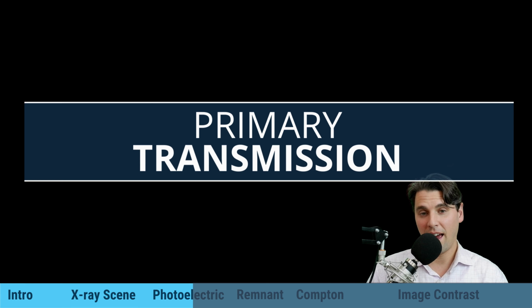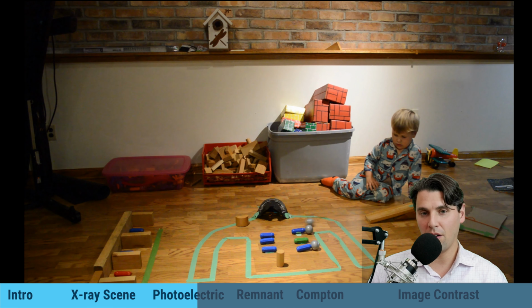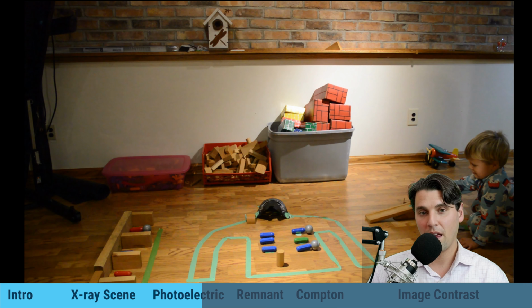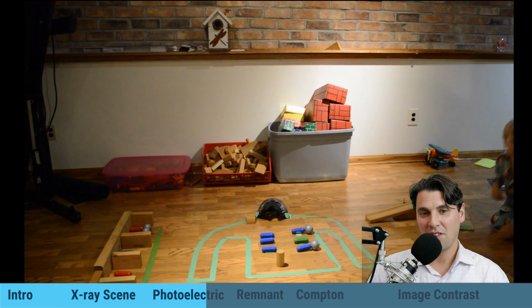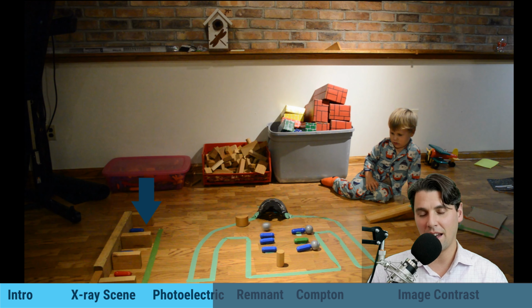Primary X-rays making it all the way through. In this case, we call them remnant X-rays, the X-rays which make it through the patient and which then can be measured on the detector. So in this case, you see the X-ray passing all the way through, not interacting at all in the patient, and getting measured on the detector.